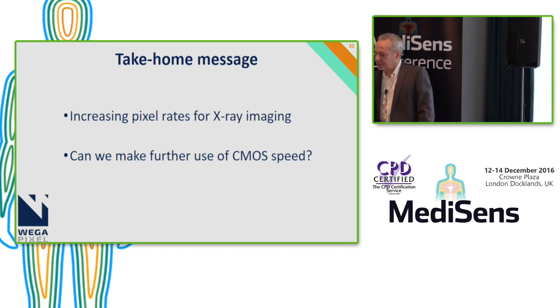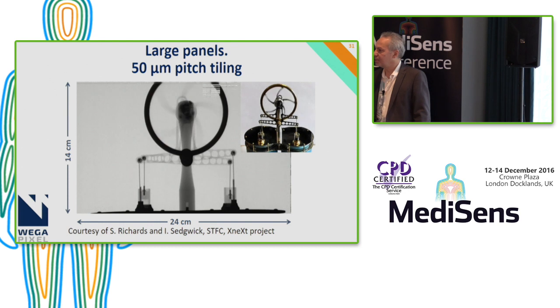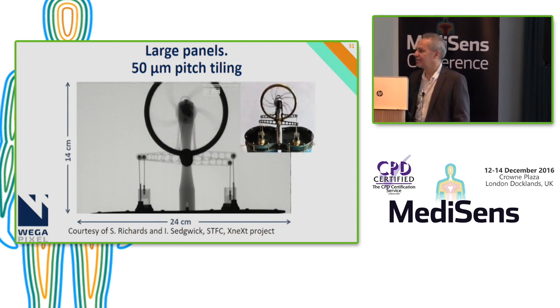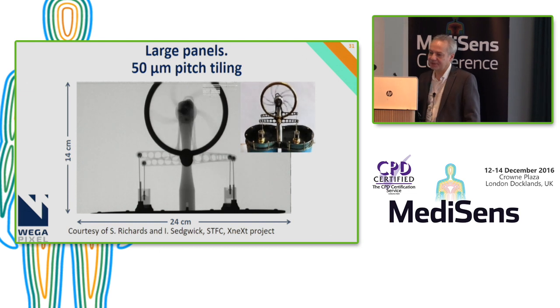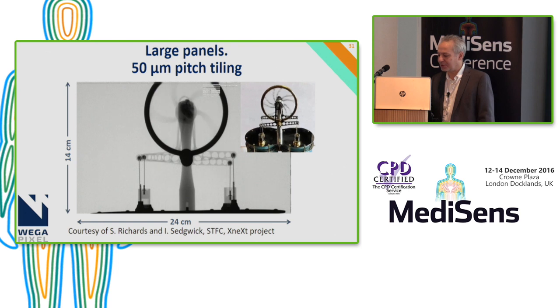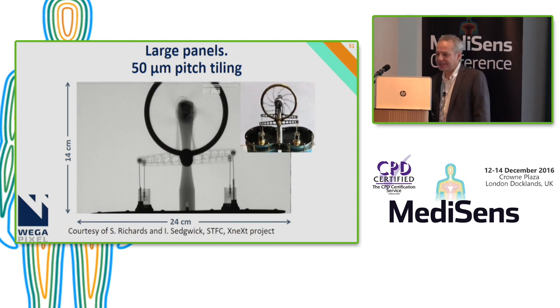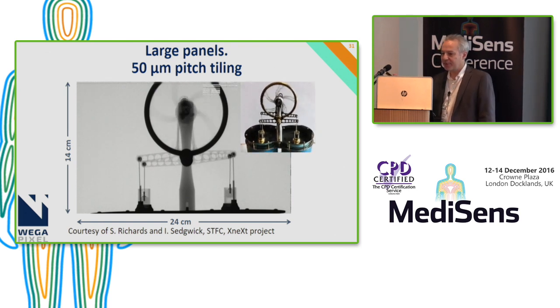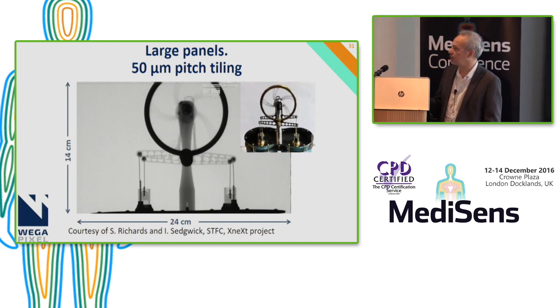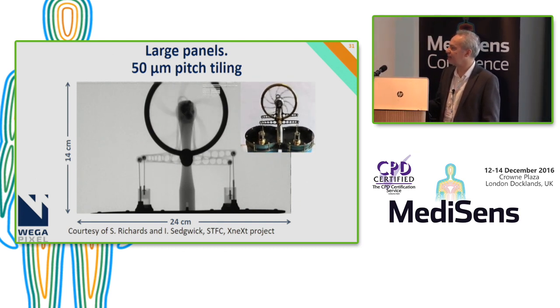And the very last section, I have one minute maybe? Already gone. Okay, but these are just videos, so we can think about questions already. This is the panel I was showing before, a two-side buttable panel with 50 micron pitch, and that's a movie from the very first example.